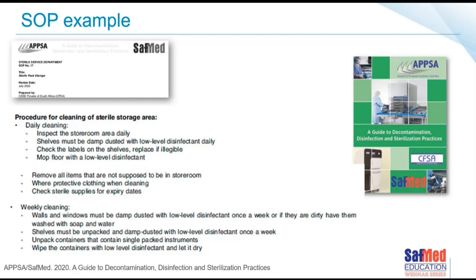Mopping the floor, removing all items that are not supposed to be in the storeroom out of the storeroom, wearing correct clothing, protective clothing when cleaning, and checking sterile stores for expiry dates. Weekly cleaning, walls and windows, if there are any, windows that is, damp dust as required. Shelves must be unpacked and damp dusted properly once a week. Unpack containers that contain single packed items, because a lot of those containers often have hordes of green dust in them. Don't forget to wipe out those containers, but also to let them dry before you put the items back inside of the containers.